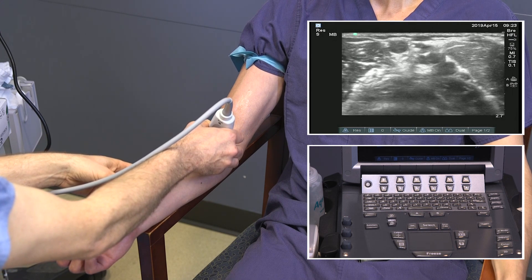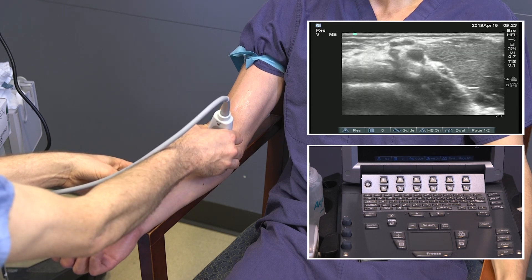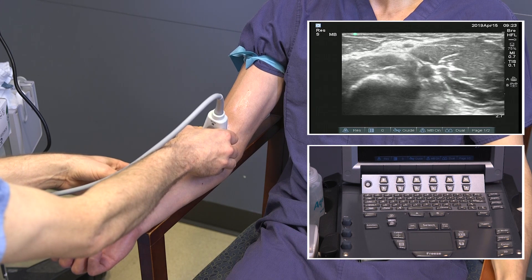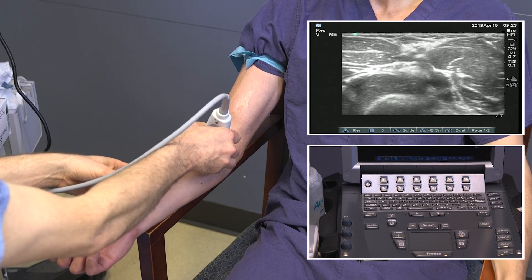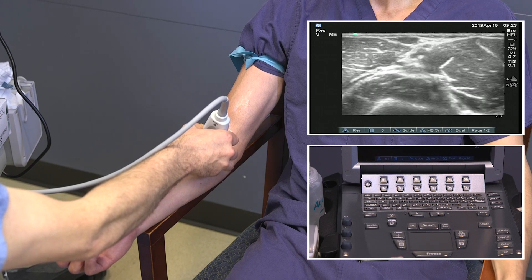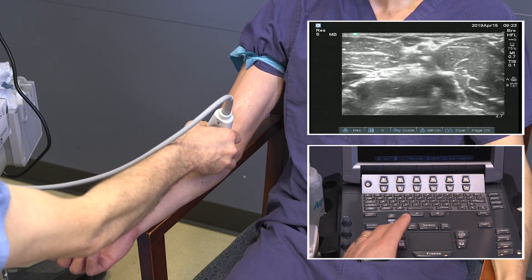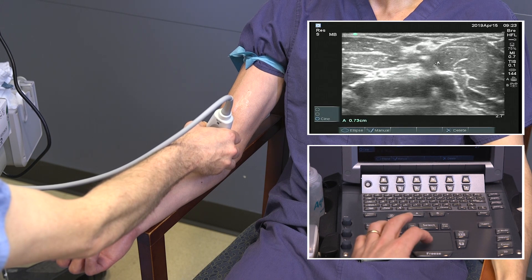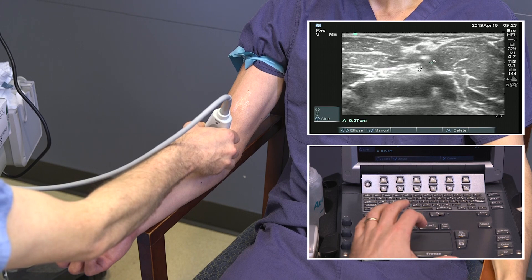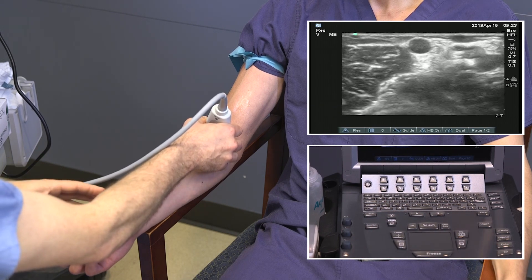As we follow it down below the elbow, we see the arterial bifurcation with the smaller radial artery more superficially and the larger ulnar artery deeper, and the veins that associate with them. As we look here, we see one of the paired ulnar veins and the deeper ulnar vein.